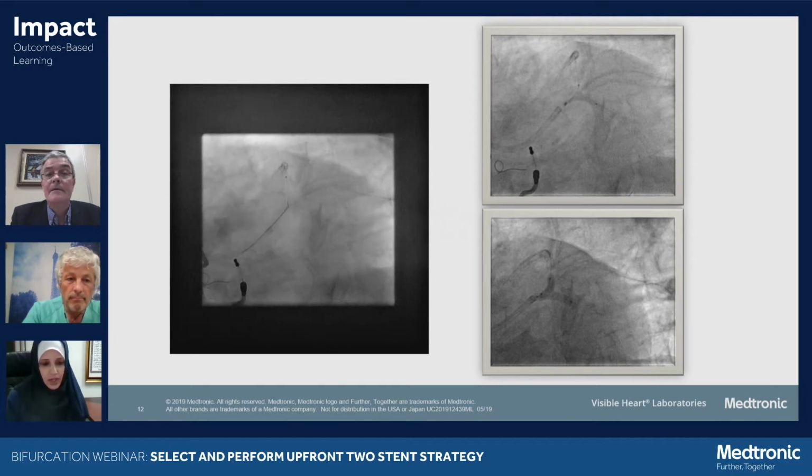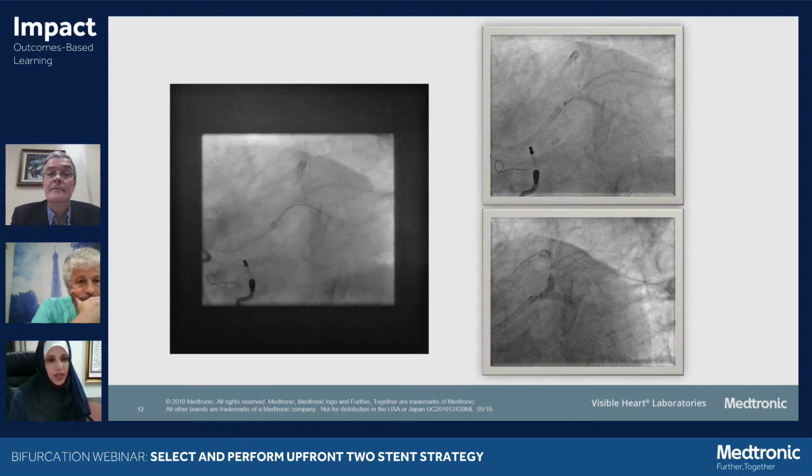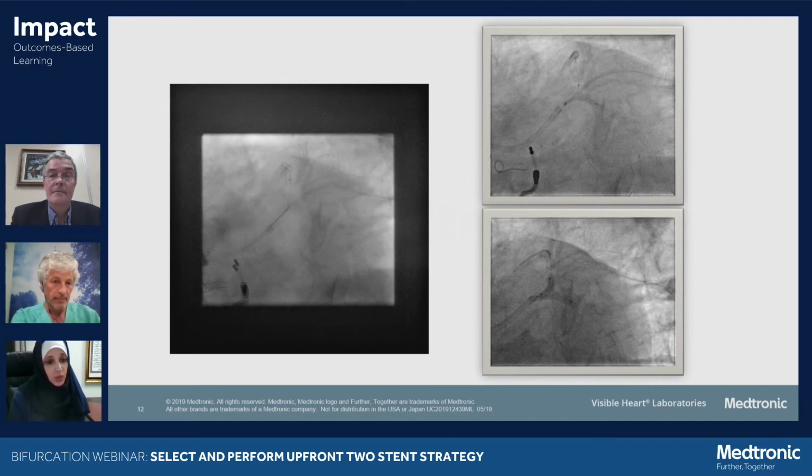So, you know, I'm not an expert in OCT, but OCT gives you depth. So if you're actually planning some kind of atherectomy, it helps you determine how deep your calcium is and to determine which atherectomy device you want to go with. And that's really why. I know there are some centers that are more comfortable with IVUS, and in our center, we actually do more IVUS than OCT. So I'm more IVUS trained than OCT trained, to be honest. But as I said, we usually do it when we're looking for calcification and how deep that calcium is.